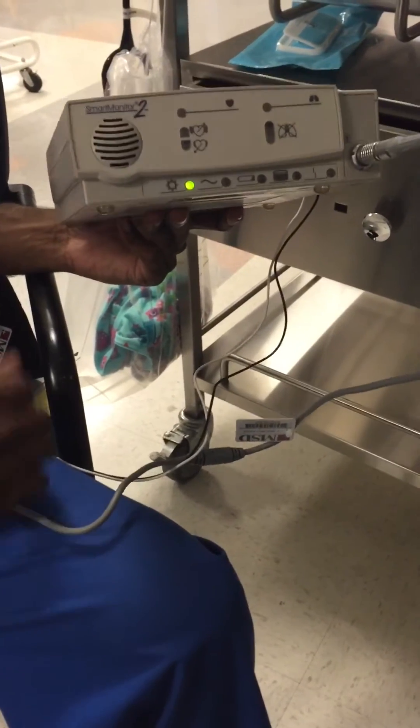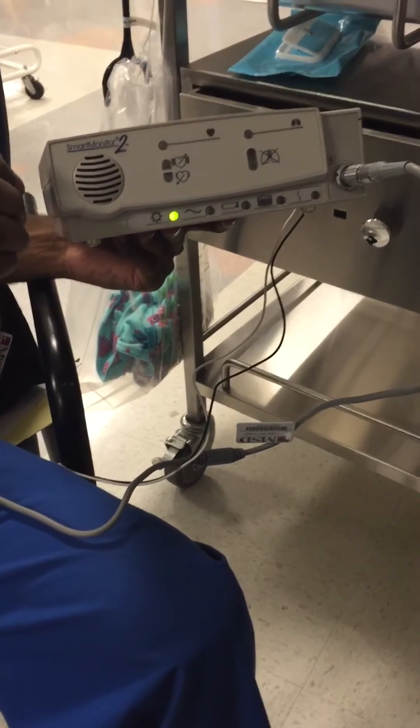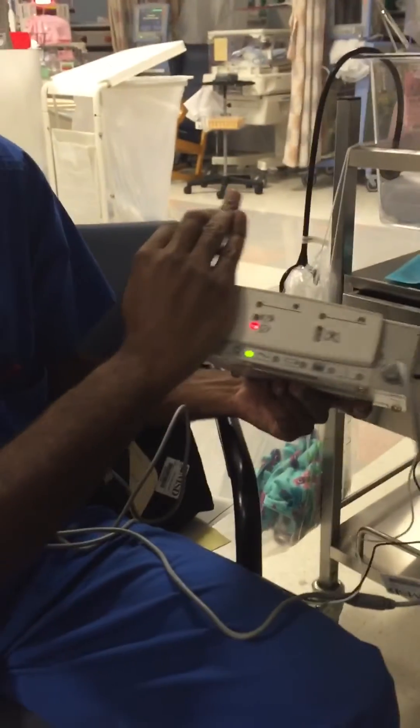It's going to go off now — I'm setting it up. So all three of those alarm lights are going to sound like that.